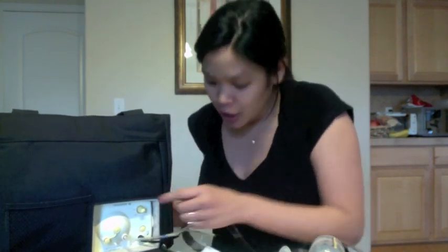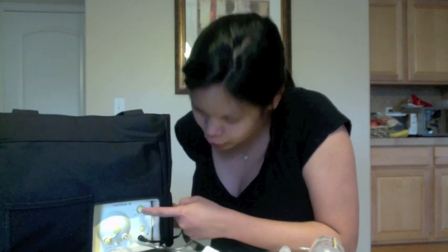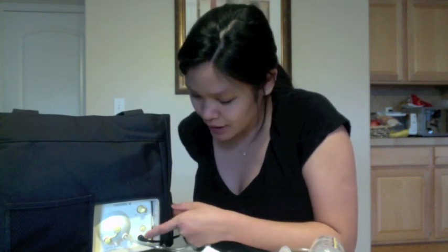There's one kind that I really like, and you can look on my blog and it'll let you know what the brand is. But otherwise, for one-handed, you just go ahead and put it on your breast, and then let's see, hopefully you can see this pretty well. There's one knob to turn it on, and then there is this button here. What you first want to do is turn it on, and if you can tell, it's suctioning and it's doing very quick little pulses.